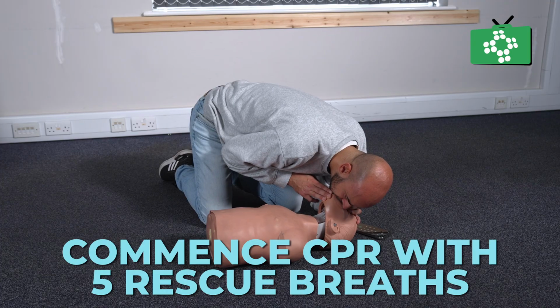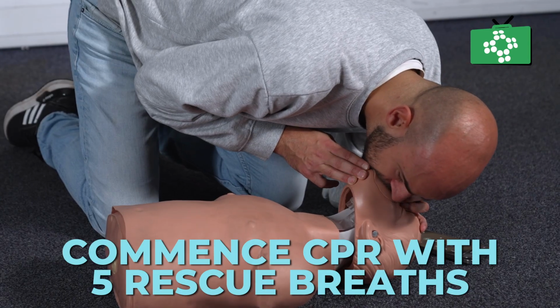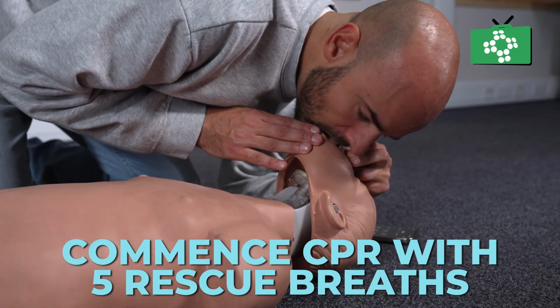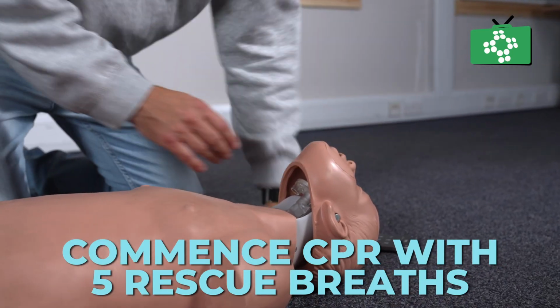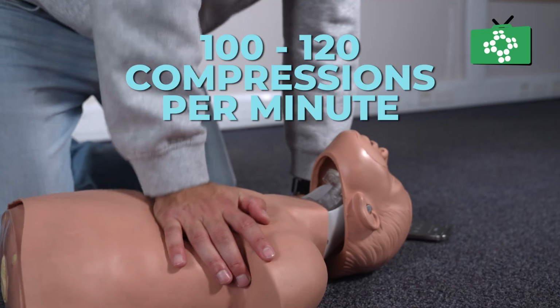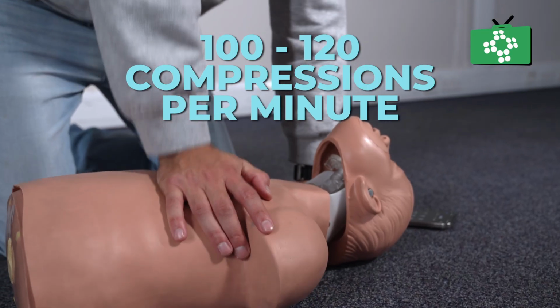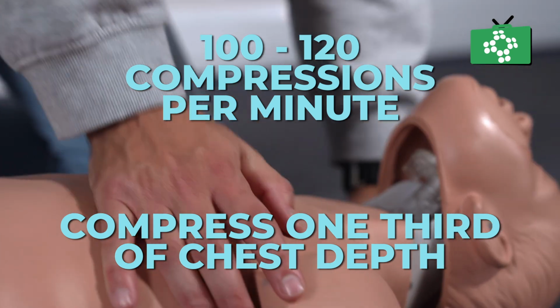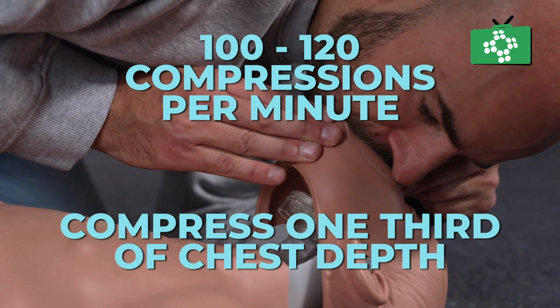Start CPR straight away. For children, when they collapse, it's usually due to a breathing problem, so start with 5 rescue breaths before beginning compressions. Chest compressions should be at a rate of 100 to 120 per minute. Compress the chest to around 1/3 of its depth, ensuring full recoil of the chest.